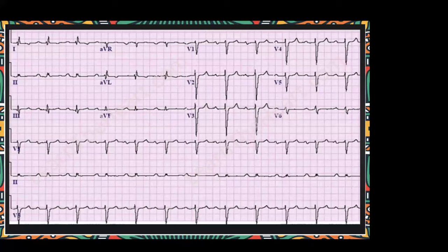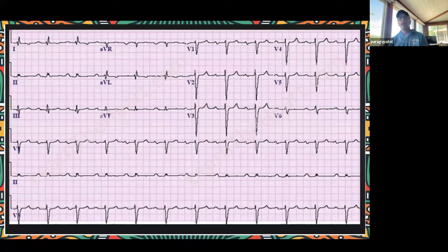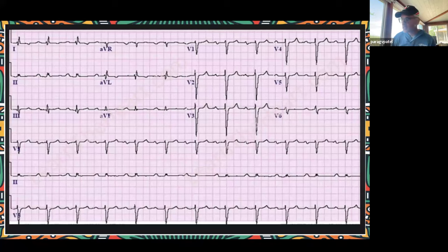We're going to jump to the next one. Fast or slow, regular or irregular, QRS narrow or wide? Are there P waves before each QRS, and is there a relationship? Who wants to take a quick stab at this one?